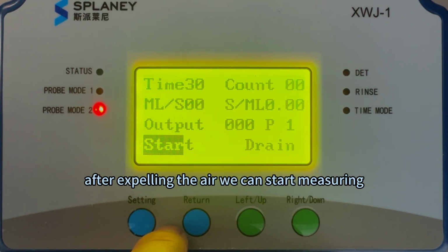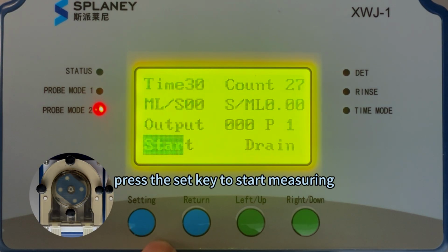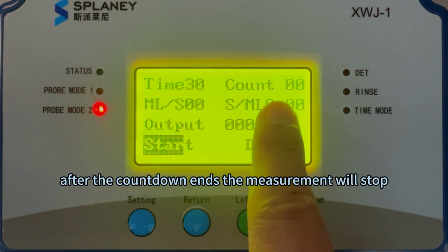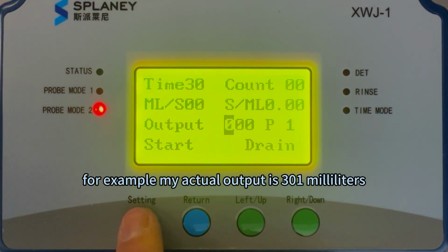After expelling the air, we can start measuring the pump flow rate. We go to the Start option, press the set key to start measuring. You can see here on the right it is counting down. After the countdown ends, the measurement will stop. Then we enter the measured value into the actual output. For example, my actual output is 301 milliliters.